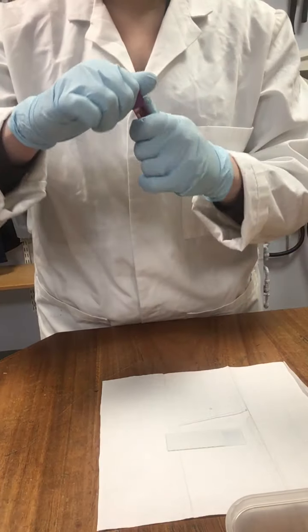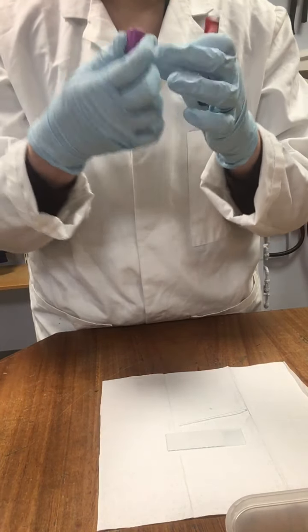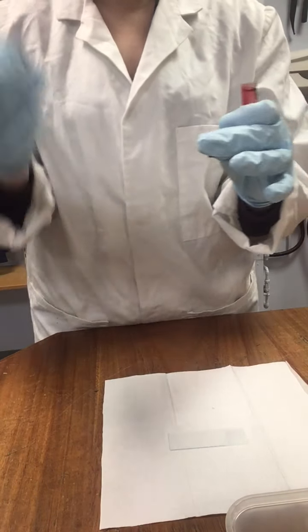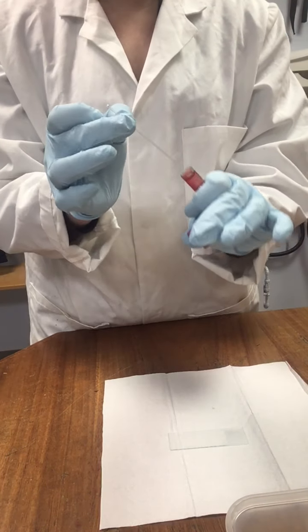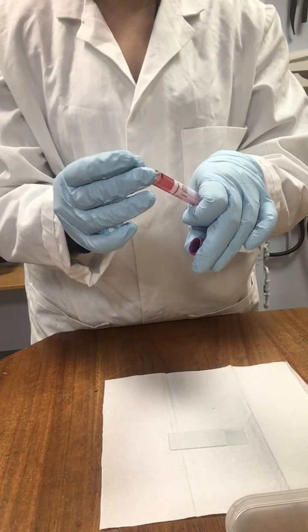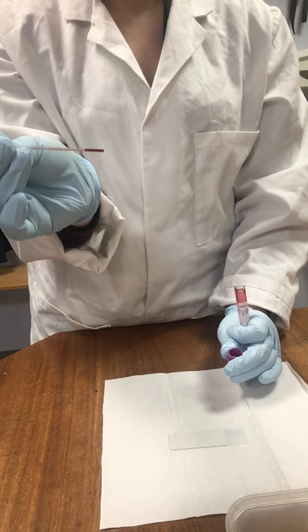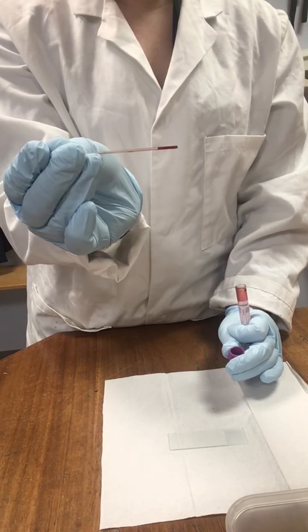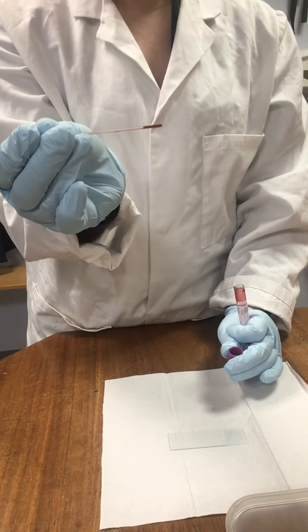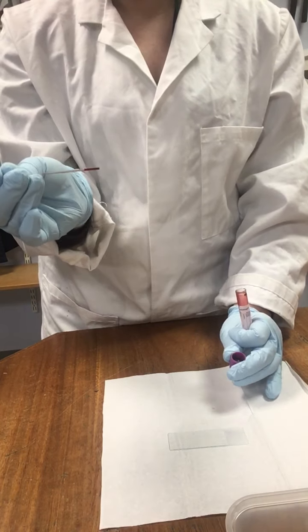Okay, so with our blood sample, taking our lid off carefully, making sure we don't contaminate ourselves or the workbench, we want to take our capillary tube and just pop it into our blood sample, and what it will do is it will naturally gather a small amount of blood at the end of it. You need to make sure that you put your finger on the end of the tube, as otherwise the blood will be able to drip out of the tube.